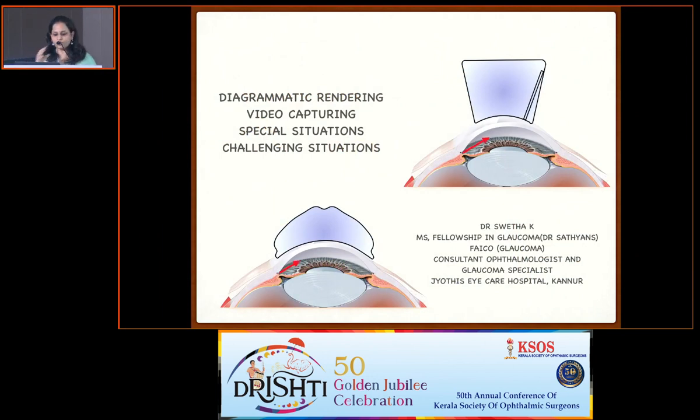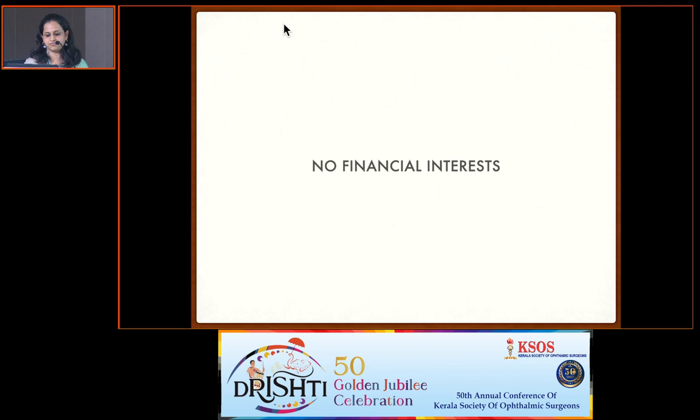So now after seeing the normal angles, I'll be talking about diagrammatic rendering, video capturing, special situations and challenging situations. So doing a gonioscopy in your routine glaucoma workup is really important, but equally important is documenting it. Because next time when you see the patient, you won't be remembering what exactly you have seen. So that is the importance of diagrammatic rendering. It is also useful for patient education as well as for training your postgraduates or your fellows, because we know how much difficulty we had in our postgraduate period doing a gonioscopy. It was really difficult. I do not have any financial interest.